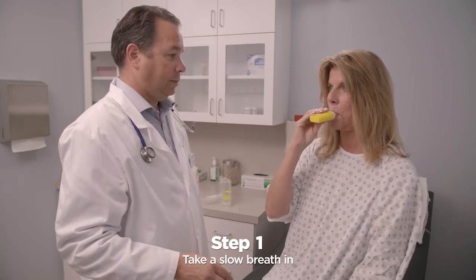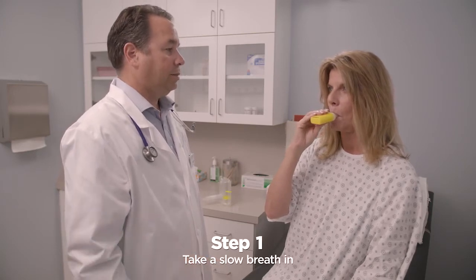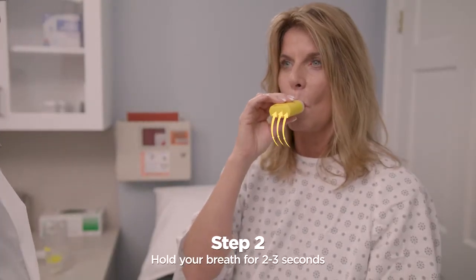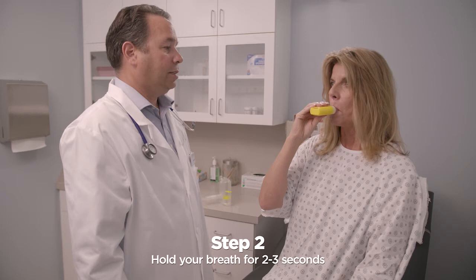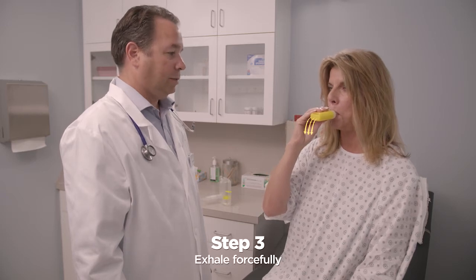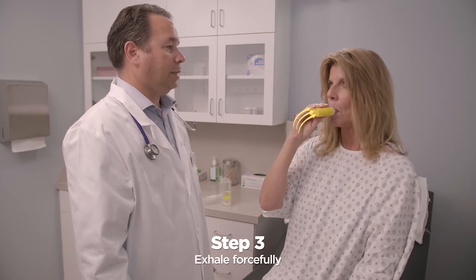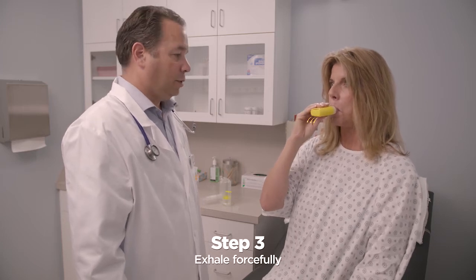Take in a very slow, deeper breath than normal, but do not fill your lungs all the way. Hold your breath for two to three seconds. Breathe out through the mouthpiece with more force than normal. Keep your cheeks flat and not puffed out. This will help you get the best from your treatment.